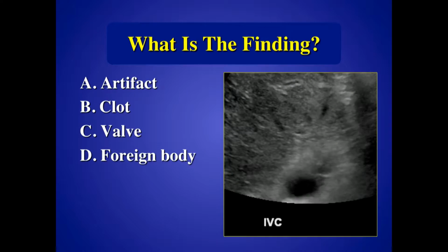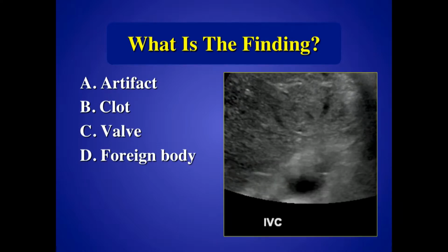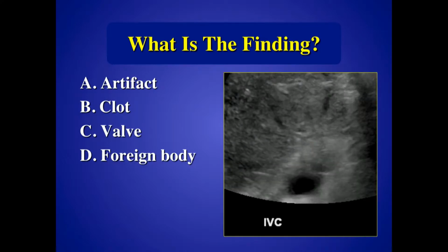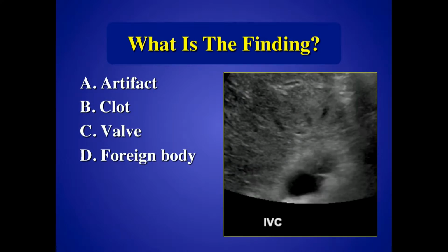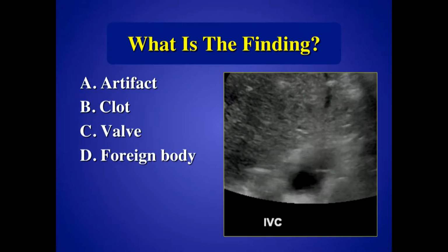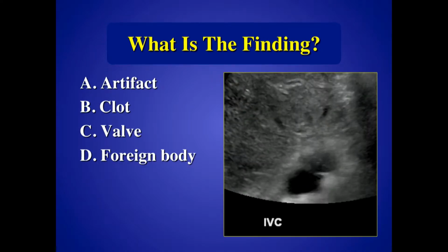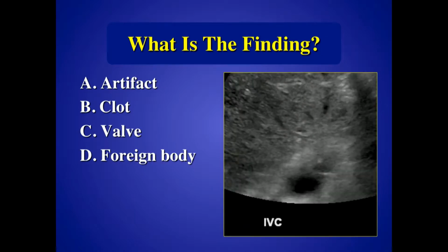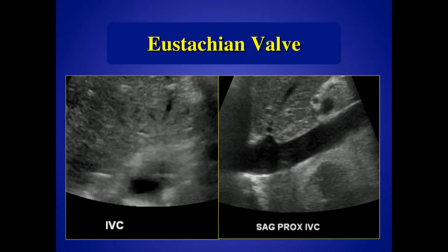Almost never, right? Most of the valves are lower down. Lots of valves in the calf, right, to propel blood back toward the heart. You get fewer valves in the thigh at the femoral vessels. And as you move up through the iliacs and the IVC, you practically lose all your valves. But you're right, it is a valve. It's called the Eustachian valve.